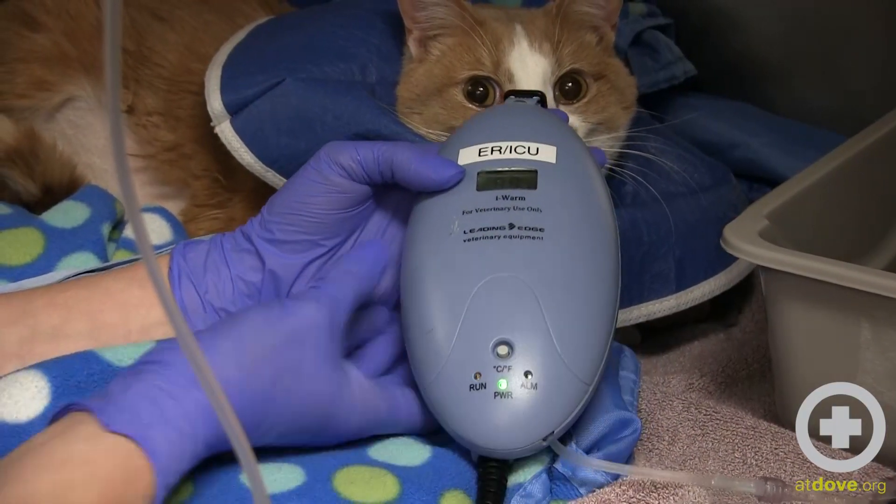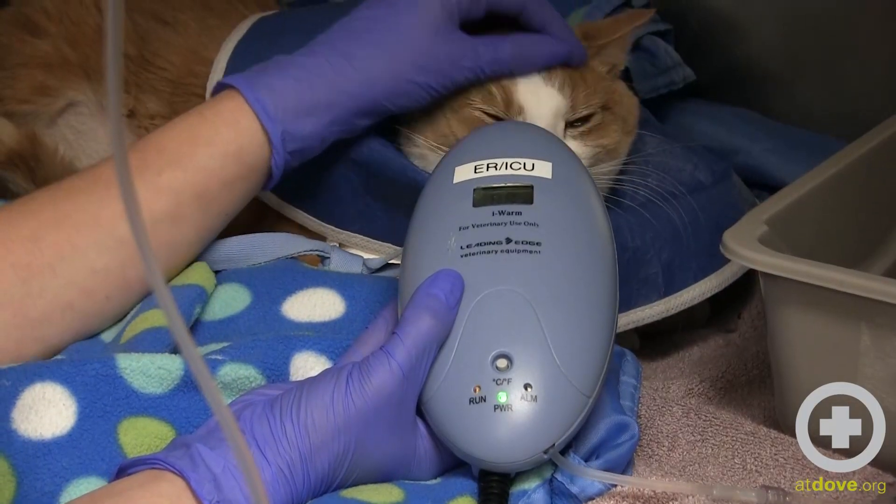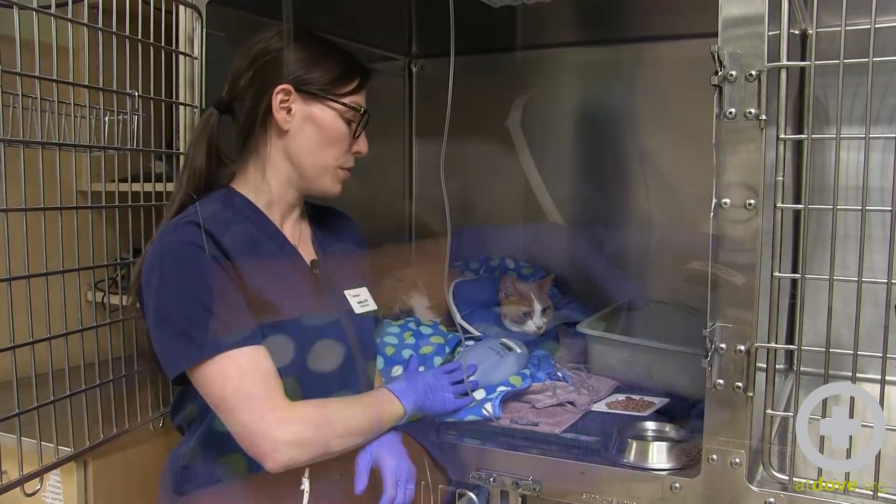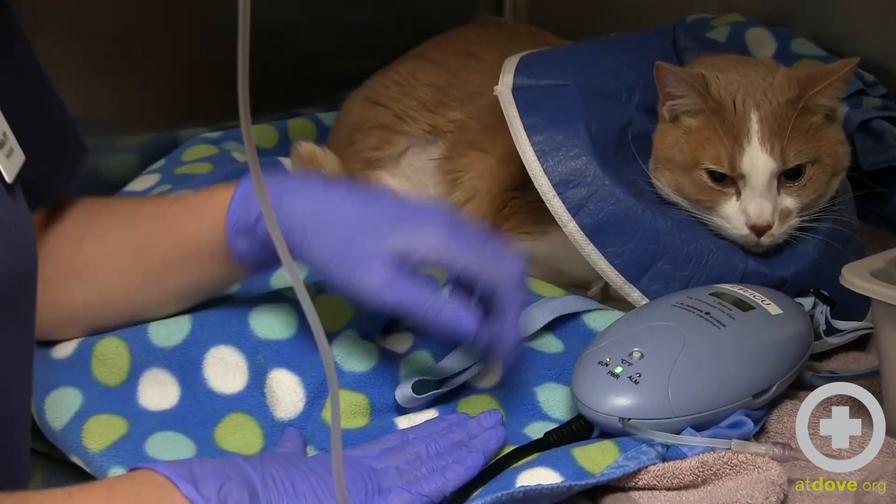Hypothermia is very common in emergency medicine, and one of the ways that we can help get their core temperature up is a fluid warmer. The most important thing when setting up the IV fluid warmer is to have it no more than 10 inches away from a patient.